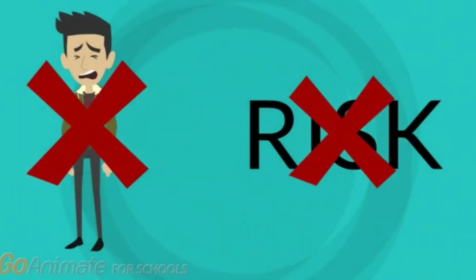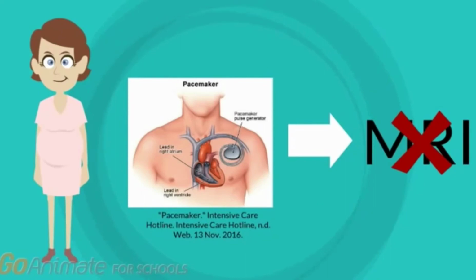For the most part, this procedure is painless and risk-free. It should be noted that pregnant women or anyone with a pacemaker or any sort of metal implant cannot do an MRI scan due to its powerful magnetic force.